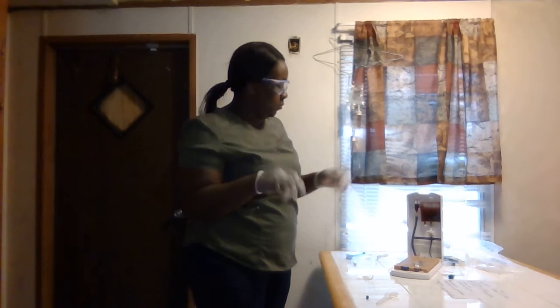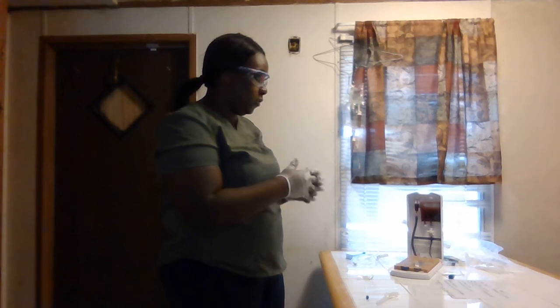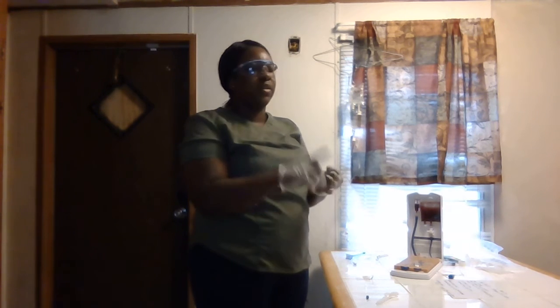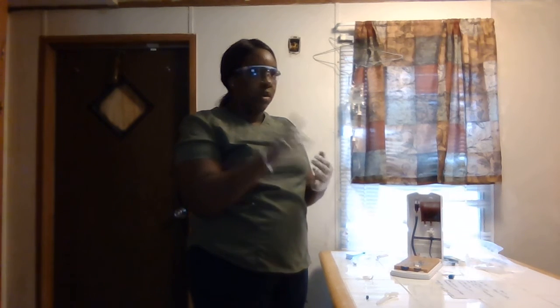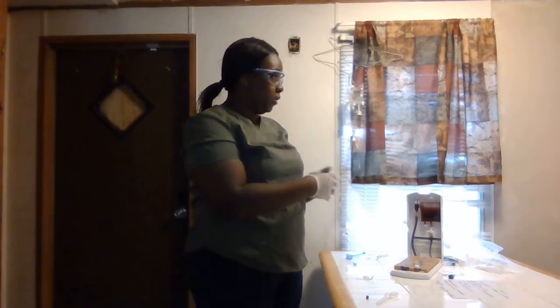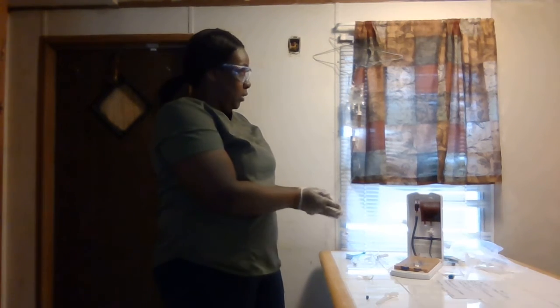And again, before we do anything with the antibiotic, we always ask the patient if they have any allergies. Any allergies to, and I should have done it at the beginning, any allergies to latex, chloroprep, iodine, betadine, and shellfish. And my patient only has allergies to aspirin and penicillin. So again, that's what we would ask in the beginning, when we're hanging an antibiotic. And that's it for that. Take my gloves off, remove my goggles, wash my hands, and I'm going to document.